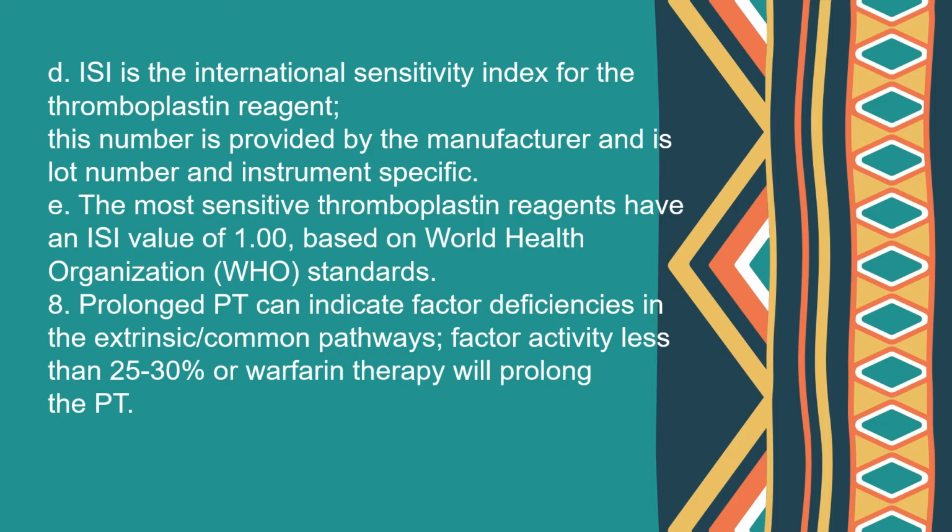Prolonged PT may indicate deficiencies in the factors that are found in the extrinsic and common pathways. If there is less than 25 to 30% activity, or warfarin therapy can actually prolong this value.